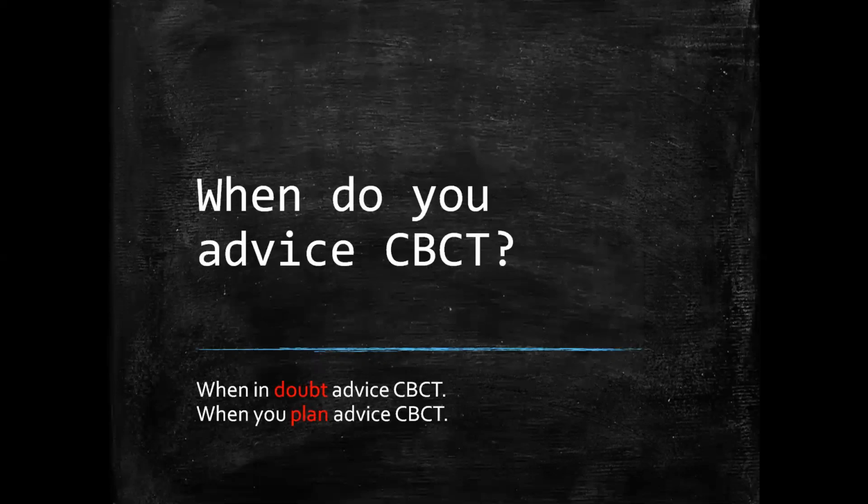Now another big question is, when do we advise CBCT? As I told you, CBCT holds the gold standard. So whenever you are in doubt, you should advise a CBCT.